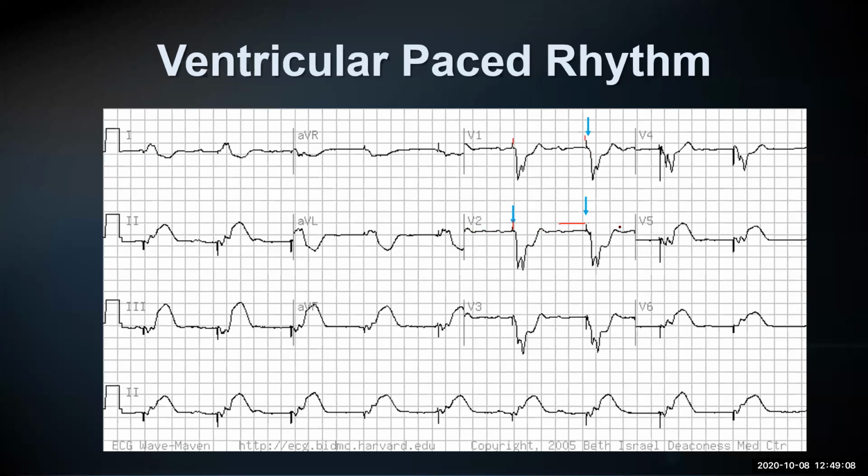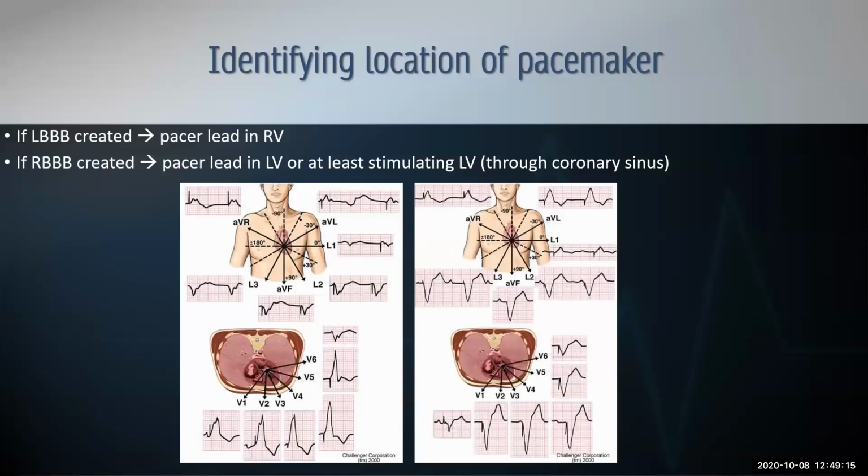I think on the second part of my diagnostic test lecture, we'll go over the different modes for pacemakers. So I'll leave that for the later talk. But maybe I'm not leaving it. Sometimes I forget what I've talked about. This is the last slide for pacemakers.